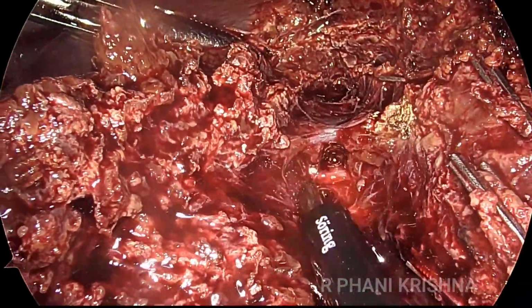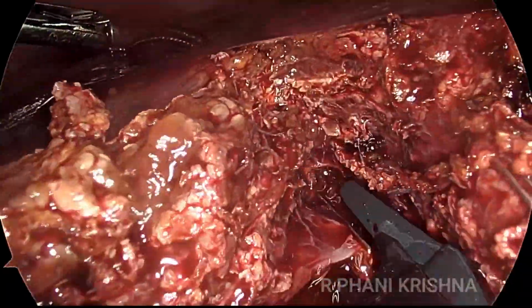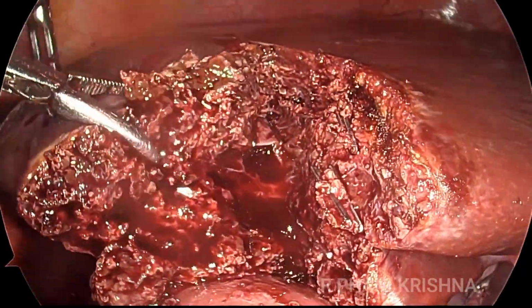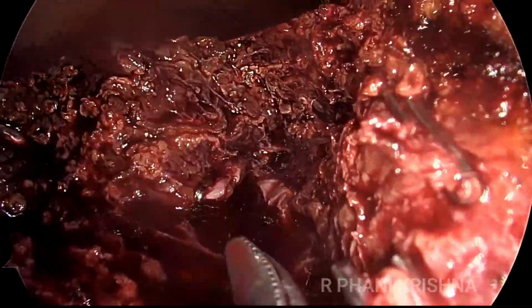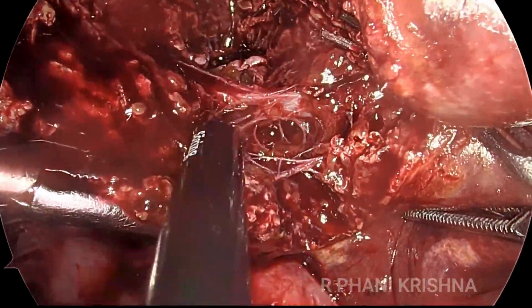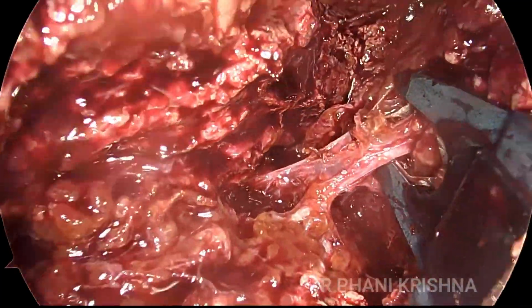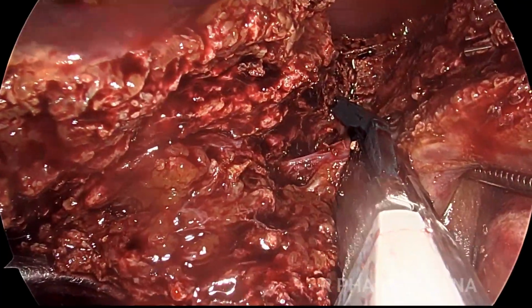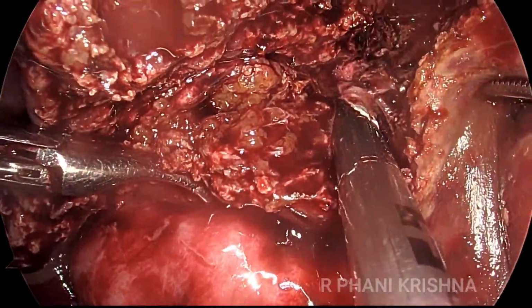So in the segment wedge liver resection, to prevent bleeding and bile leaks, a couple of important structures. Basically, the Glisonian pedicles in the medial part of the dissection. In the superior part of the dissection, you have the middle hepatic vein pedicles, and in the inferiormost part of the dissection towards the hilum, you identify and clip the segment 5 pedicle. This is again the Glisonian pedicles from the segment 4 side, which we are clipping and dividing.